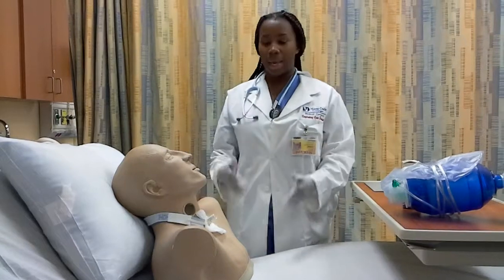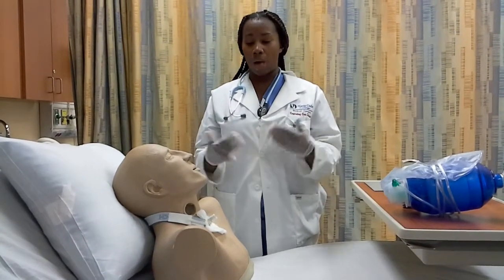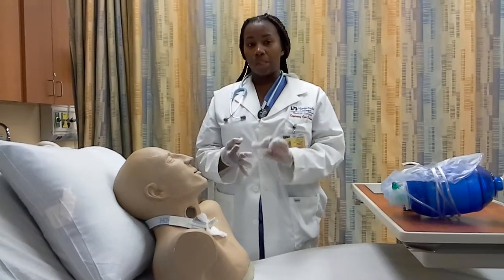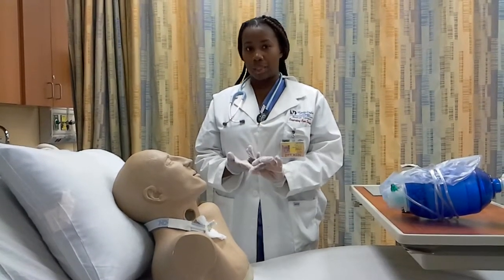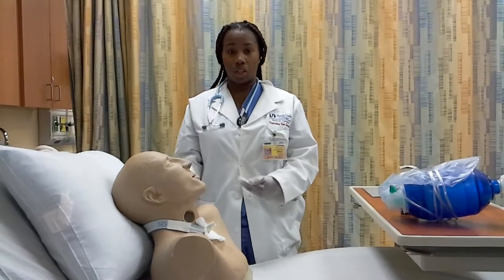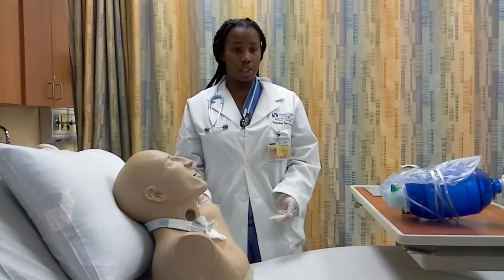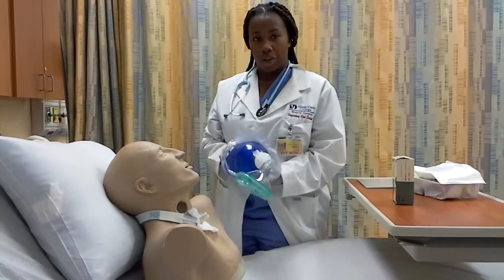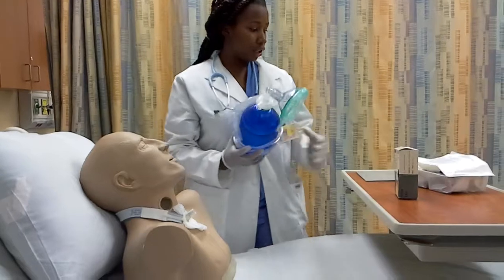Next, I'm going to go ahead and monitor his vital signs. I'll be looking for his heart rate, his respiratory rate, his pulse ox, and his breath sounds. Next, after I have monitored that to make sure they are normal before I begin the procedure, I'm going to go ahead and hyperoxygenate my patient for 30 seconds before I begin to suction.